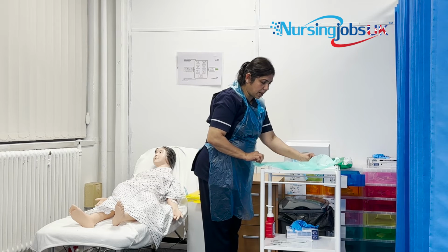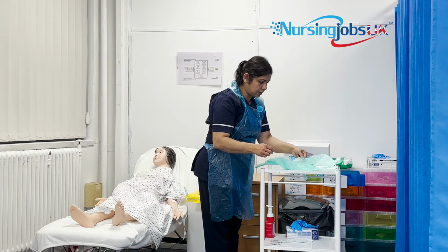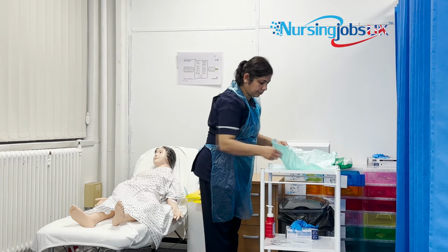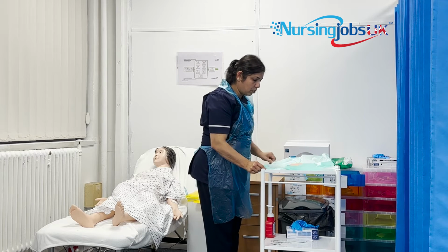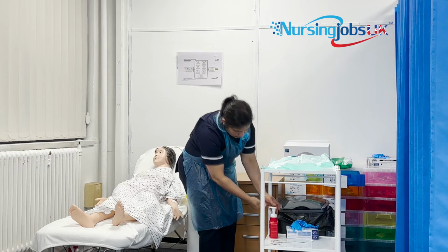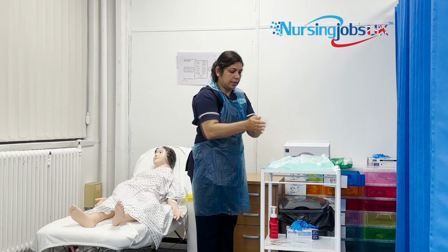So this is the main part of the ANTT, how to open your dressing bag. So wherever you're not able to, you just need to pinch like that. Then you just need to open like this. Okay. So now almost your dressing bag is nearby there. Now you need to arrange the dressing bag correctly. Before that, you need to gel the hand again.